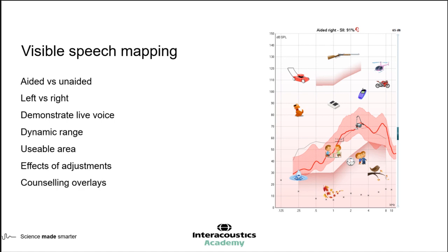And we've got our counseling overlays here. So in this particular image, it's the pictures, the images, but you could also have the speech banana on there as well to demonstrate how that relates to that particular person's loss, and also what their hearing aid is doing.